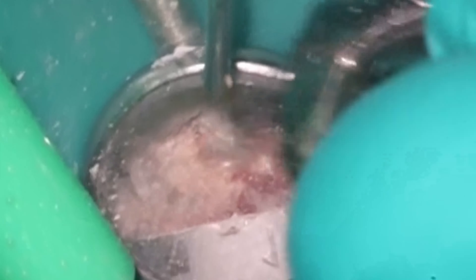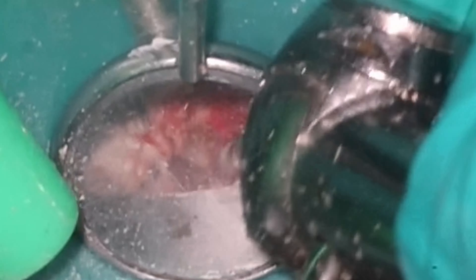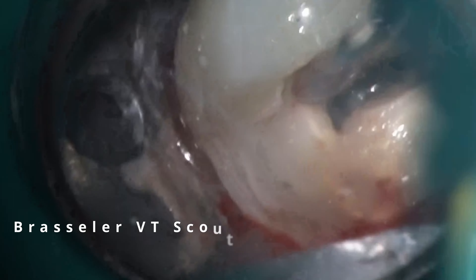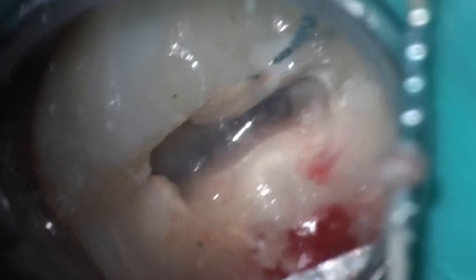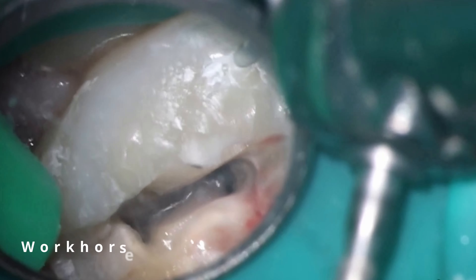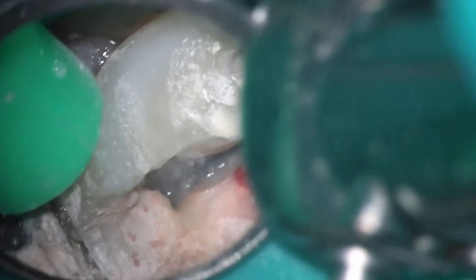You'll notice that my access is going to be a little bit different than normal. That bleeding there was more gingiva. I'll show you in a moment how I deal with the gingival tissue as well, because I do restore for this doctor. First rubber dam change — we actually had to do it twice. You can see the tooth has actually died by this point, with nasty necrotic pulp tissue inside. I'm going to use a truss-style access on this case and drill two holes. The other reason for that is it gives me more of a traditional straight-line access to those mesials where the deep curve is.